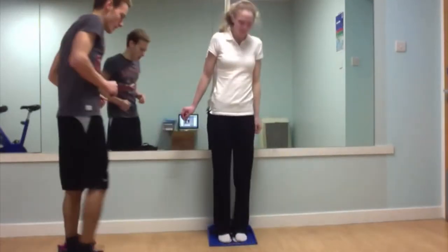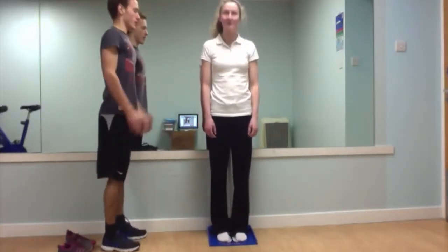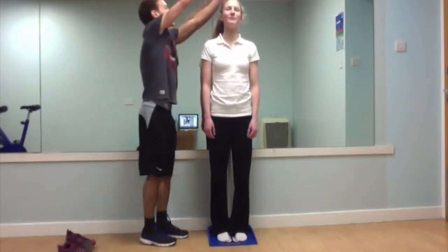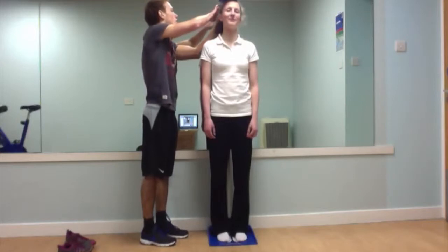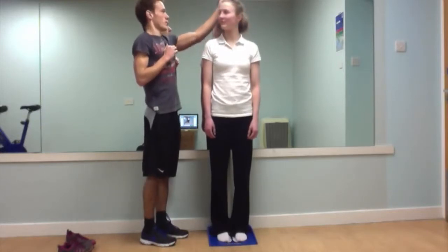If you could please step in — make sure your feet are firmly against the back. Make sure your back and legs are straight and keep looking forward. I'm going to slowly bring this down and place it on your head. We have 163.2 centimetres.